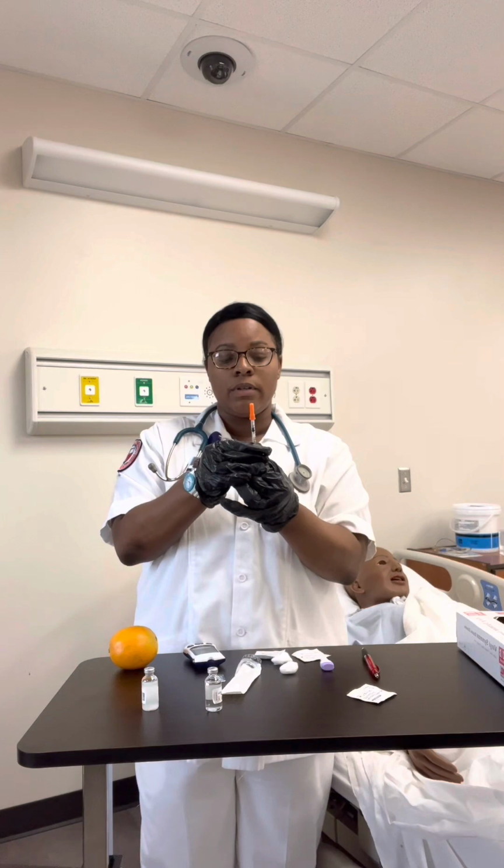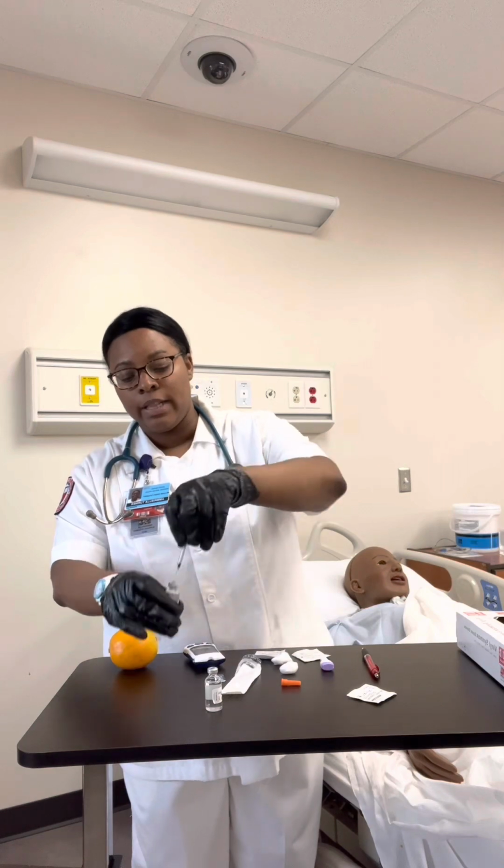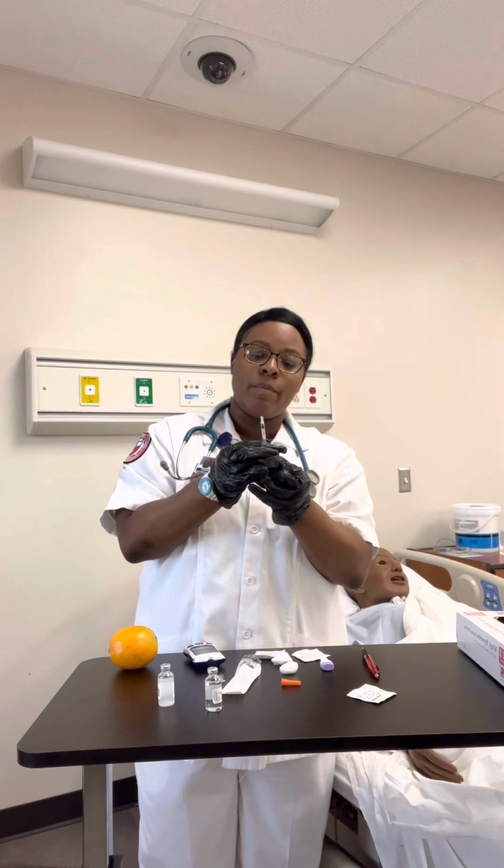According to the physician's order, the client is going to be receiving 16 units of NPH and 6 units of regular insulin. First, I'm going to wipe the vials with an alcohol swab. Then I will draw up 16 units of air to inject into the NPH, being sure not to touch the needle to the insulin. Then I would withdraw the needle and inject 6 units of air into the regular insulin.